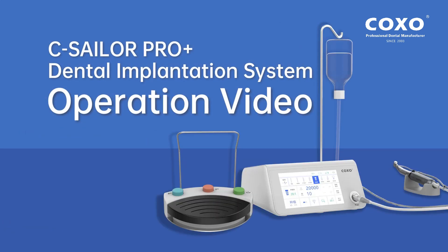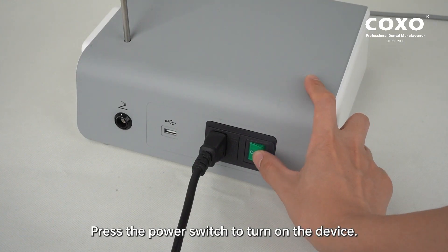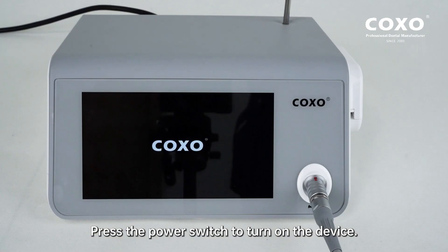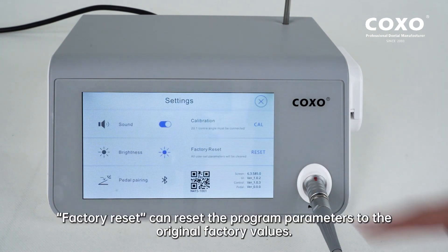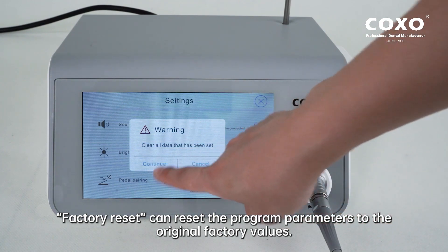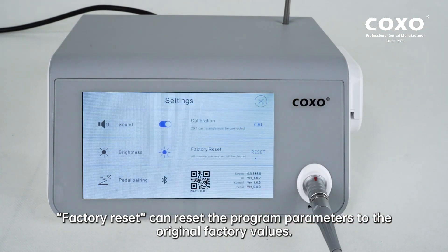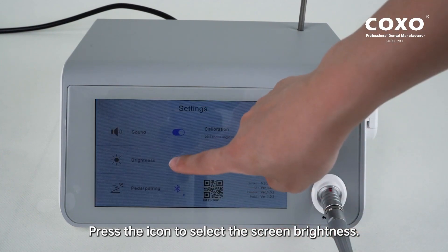Sailor Pro Plus Dental Implantation System Operation Video – Settings. Press the power switch to turn on the device. Press to enter the settings. Factory Reset can reset the program parameters to the original factory values. Press the icon to turn on or off the sound. Press the icon to select the screen brightness.